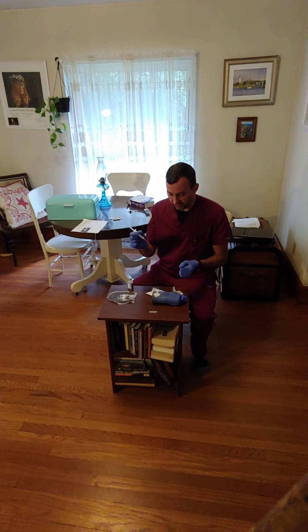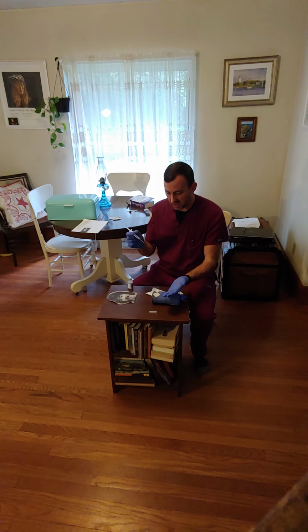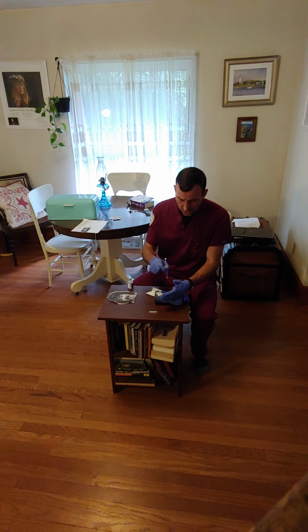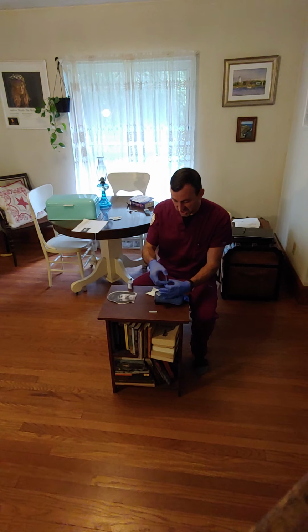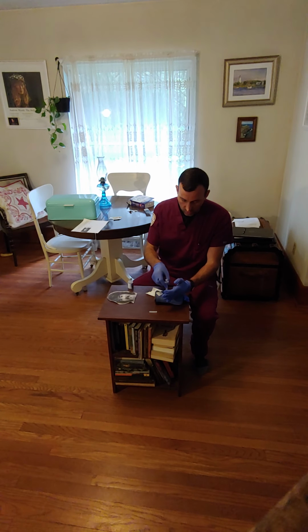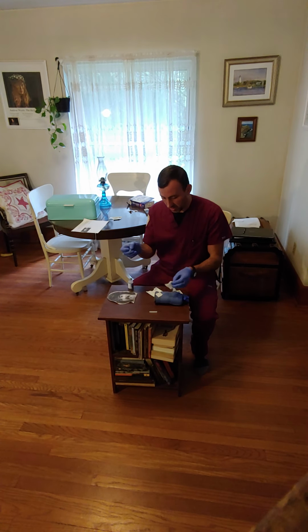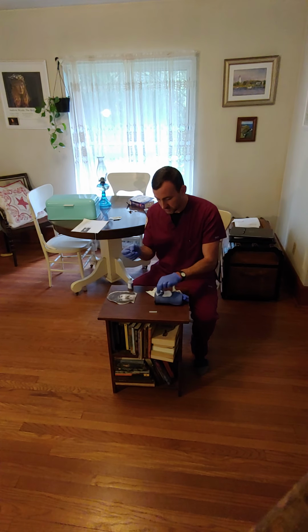And we're going to grab our syringe between our index and our thumb of our dominant hand. Okay, we've air dried, and so we're going to take our non-dominant hand and we're going to pull the skin taut in a darting motion, 90 degrees to the skin. We're going to insert the needle, going to stabilize it with our non-dominant hand. We're going to slowly inject the medication, keeping the skin taut the whole time. We're going to remove the needle in the same direction that we put it in, and then we're going to release the tension. We're going to apply very gentle pressure with the gauze on the site.